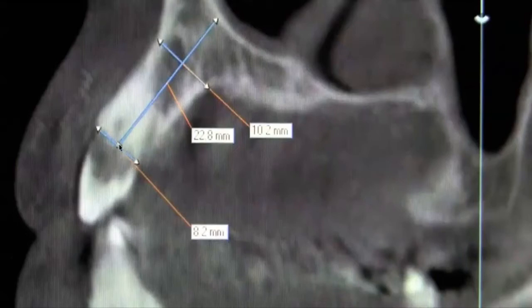So basically, we are not limited at all in the length, and we are not really limited in the width of the implant that we can select. But what is creating a big limitation is the actual position of the crown, as we can observe over here, in relationship to the root and the available triangle of bone. If we actually look at the crown and we try to create an ideal placement site, we would have to actually perforate into the facial area to place an implant.